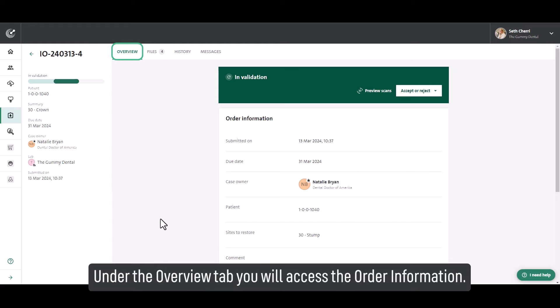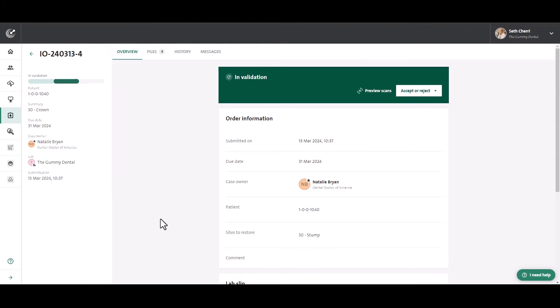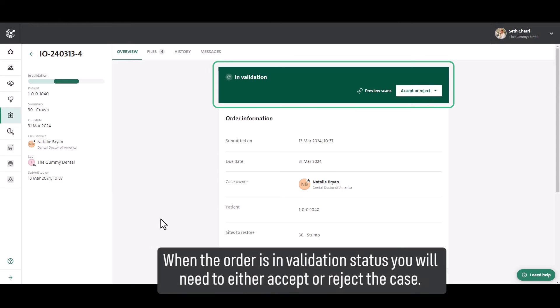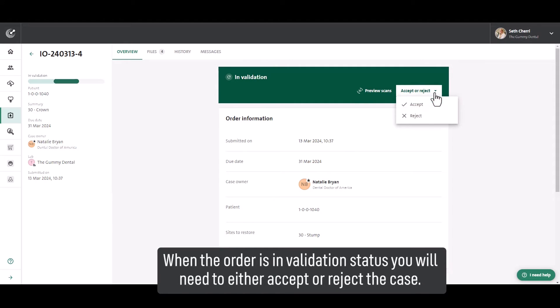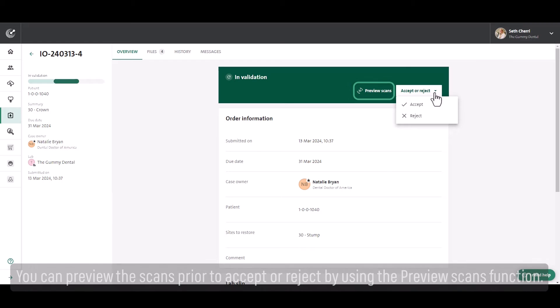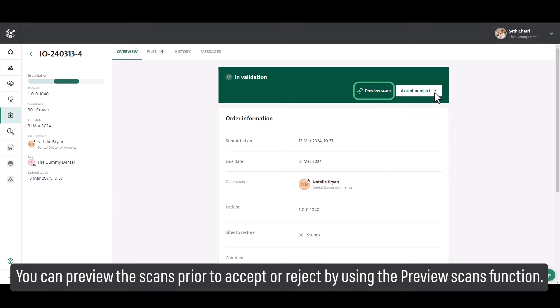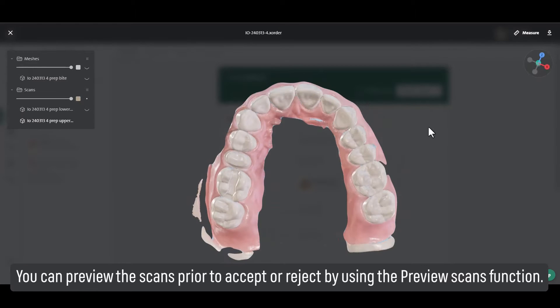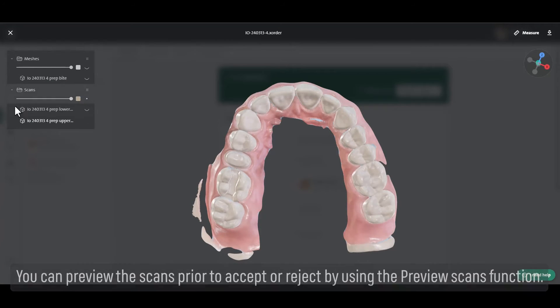Under the overview tab, you will access the order information. When the order is in validation status, you will need to either accept or reject the case. You can preview the scans prior to accepting or rejecting by using the preview scans function.